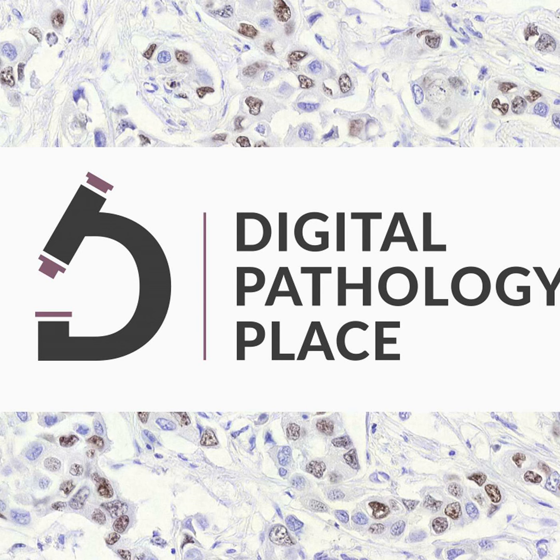And so this works well for radiology, where the images are generally relatively small in terms of individual frames or sections or slices. But when you get to digital pathology, where you have the entire slide scanned and you have hundreds of thousands of tiles and millions of pixels, and you may be annotating not just an area of tumor in a lymph node, for example, but rather every nucleus on the entire slide, then you get into a problem of scale. And just as you can do it with radiology, you can use the existing radiology mechanisms for pathology, but they become very large objects.